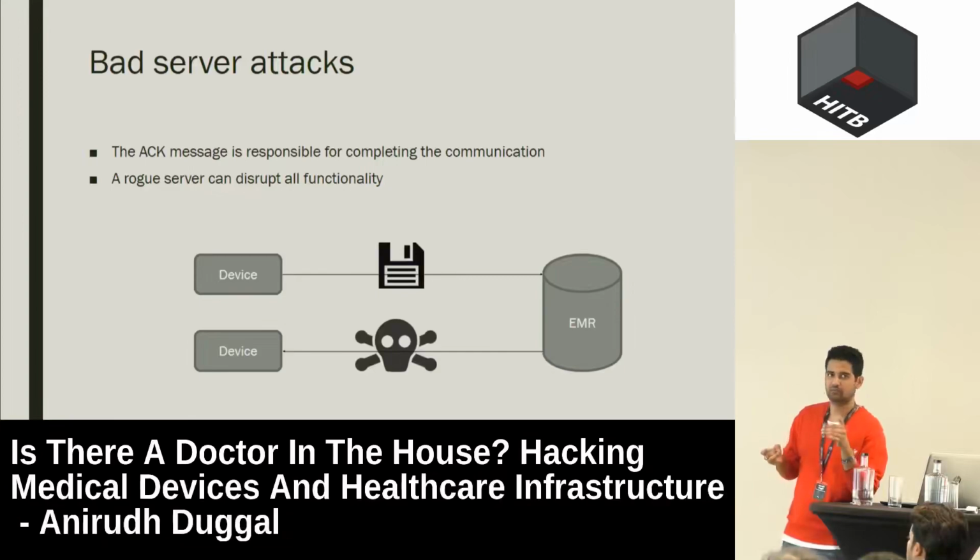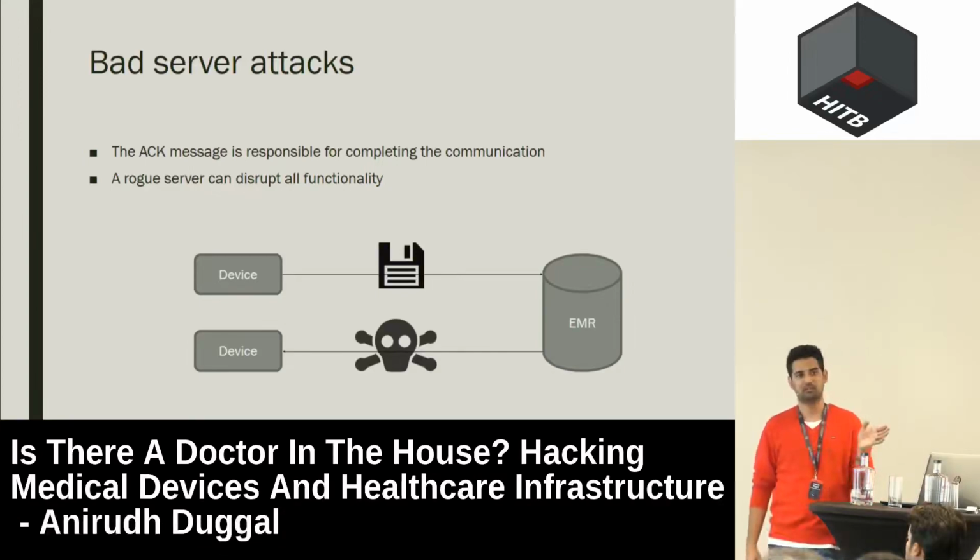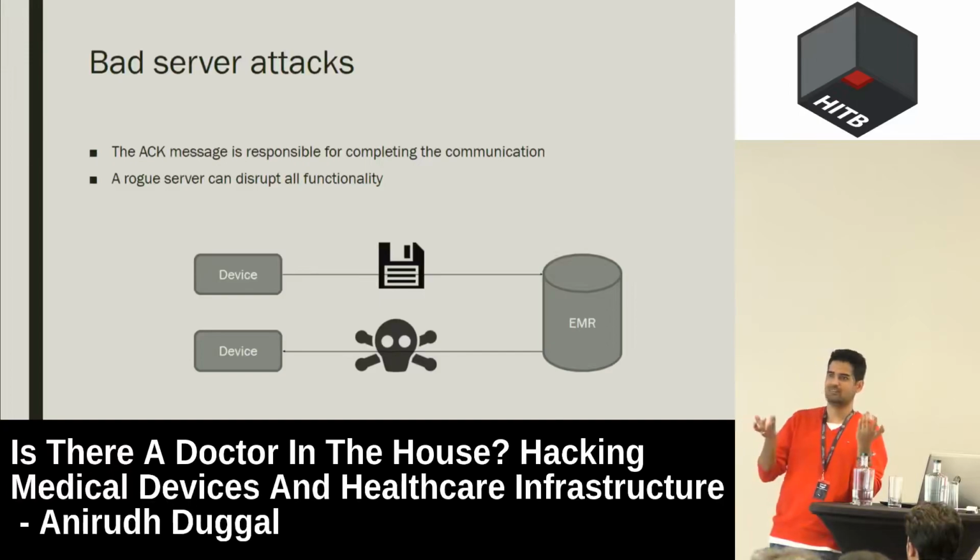So the problem with this kind of situation is, if by any chance I block that port which is sending back the acknowledgement message, your patient monitor will keep sending the same message. So let's say you have a blood pressure of, what's the normal blood pressure? Yeah. And the patient monitor is giving that reading. Someone pulls out the patient monitor, or the patient's blood pressure falls down. If your patient monitor does not get the acknowledgement back, and this is what it actually looks like.